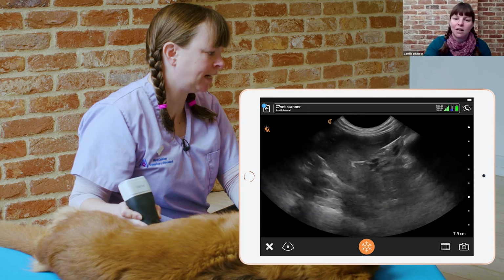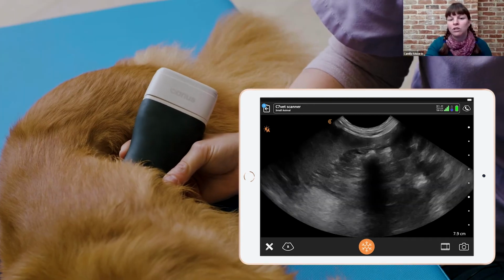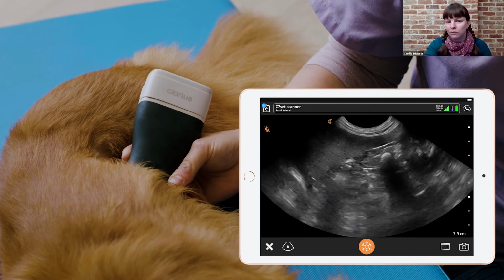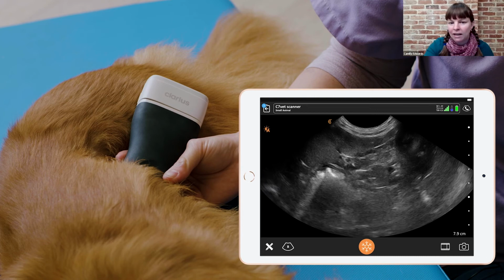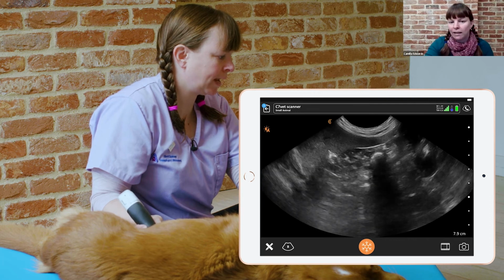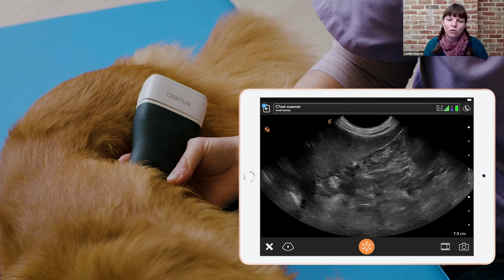And then once we get to this, where we've followed the colon until the spleen, where it then turns off to become the transverse colon, we just need to rotate the probe a little until we get the stomach in the cranial part of the abdomen. So usually when we've got this, we're at about the level of the hilus of the spleen, and we'll see the splenic vein coming off, which is moving down towards the portal vein. And it's in this area that we tend to find it. So we look out for a slightly hypoechoic structure, just caudal to the stomach by the splenic vessels.